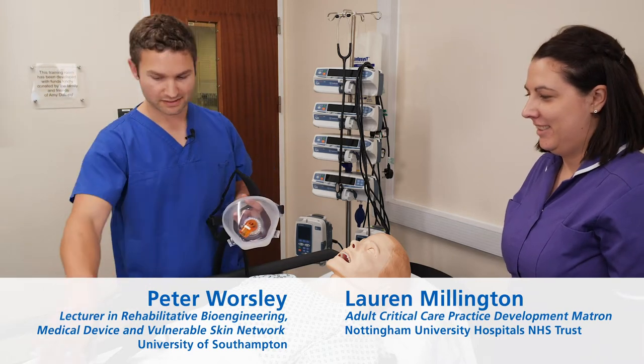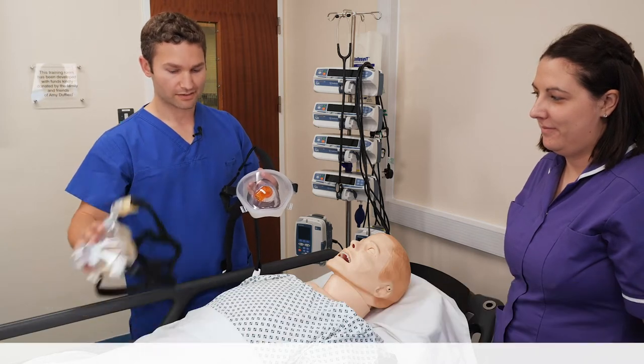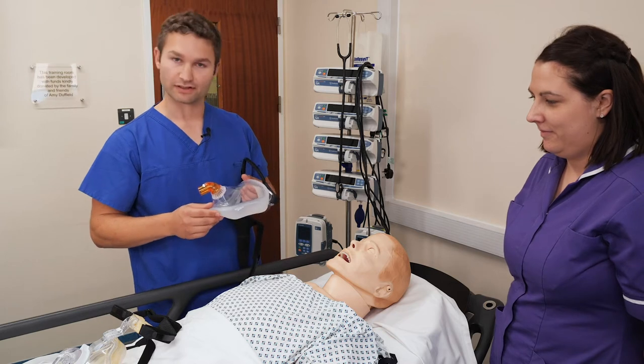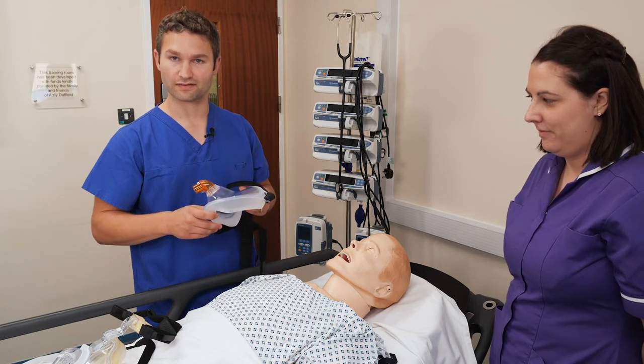Hi, my name is Pete and I'm going to go through fitting a non-invasive ventilation face mask. Masks come in different sizes and designs. Before you select the right mask, try and pick a small, medium or large to fit your patient and have a look to see at the options of both the design and the materials of the mask to fit the individual.